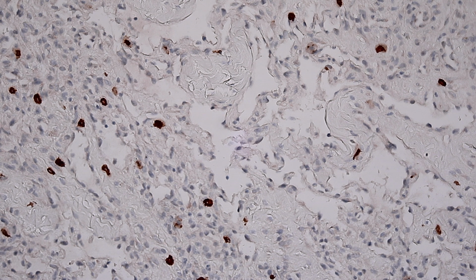So I just wanted to share that with you to remember that mast cells have this weird ability to stain with things. Even though they're not truly, I think, making those proteins, they for some reason sometimes pick up certain immunostains. And there may be others. If you have other stains you've seen stain on mast cells non-specifically, please put a comment down below, because I'm always curious to learn more about this phenomenon.